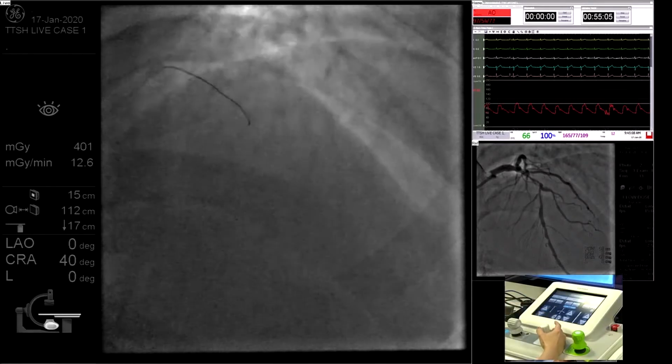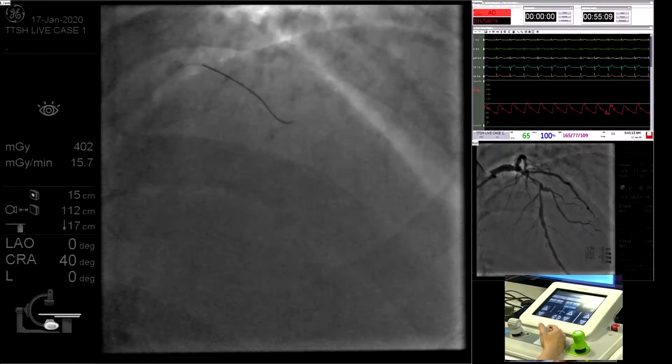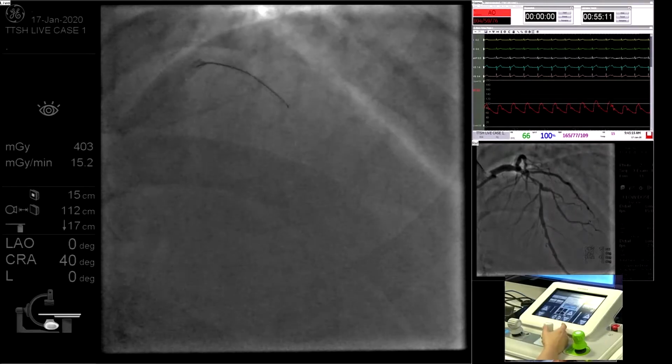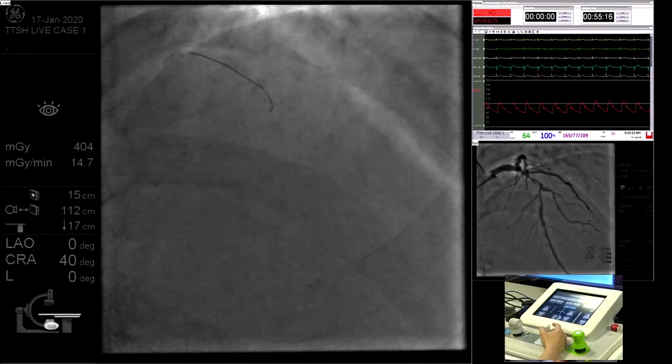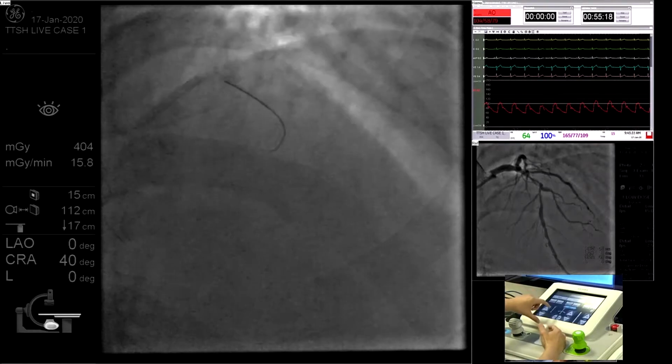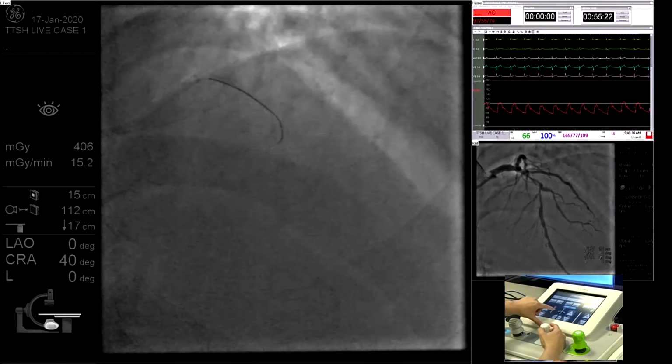You want to talk a bit on the robotics, Paul? Yeah, you can see that it can go into more or less every single branch I want. This has gone into the diagonal. There's some AI already built into the wiring maneuvers, and it will be improved even further.